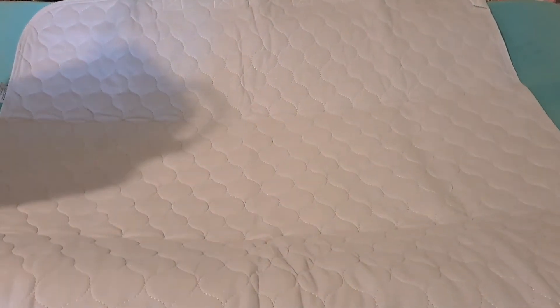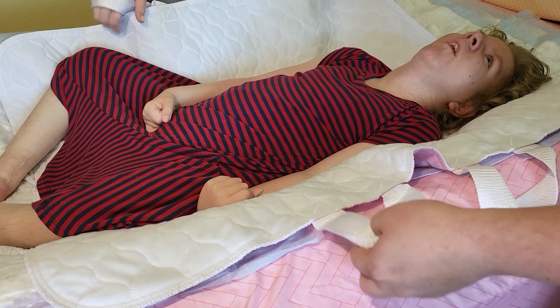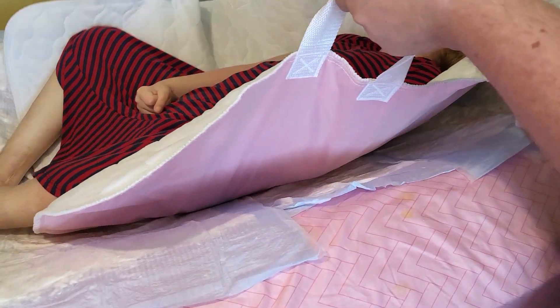It is a lot easier to turn my daughter with this, and I will show you that after we get her in bed. You can grab two corners. I'm going to lift her up some. One, two, three, up.